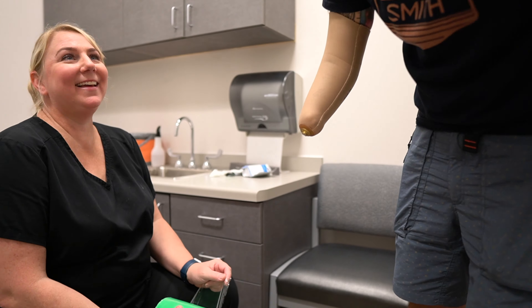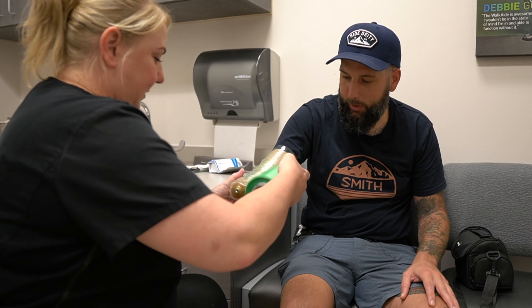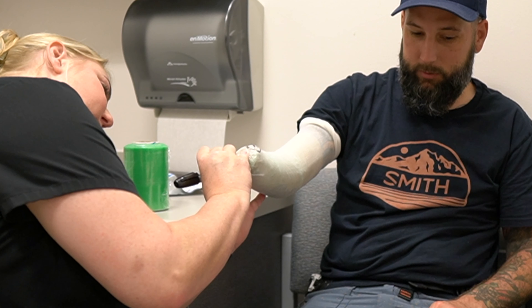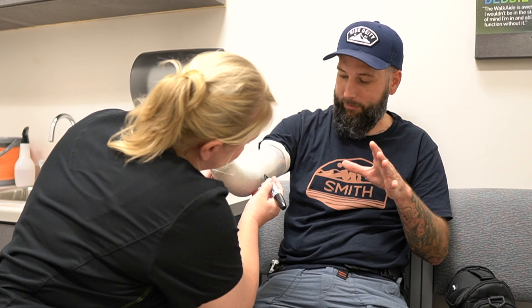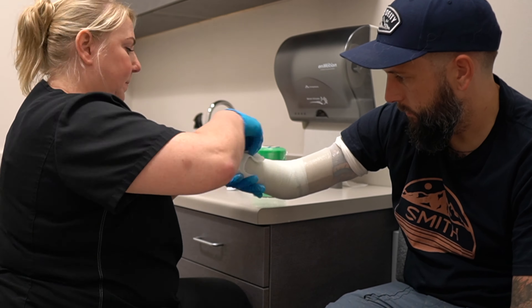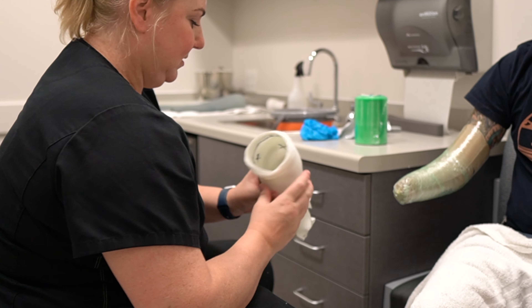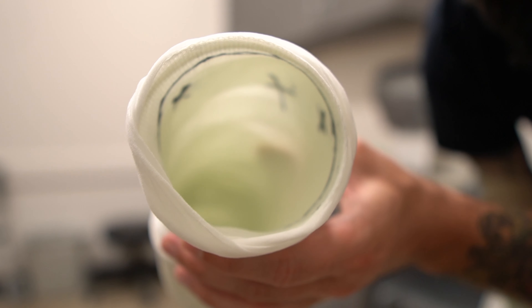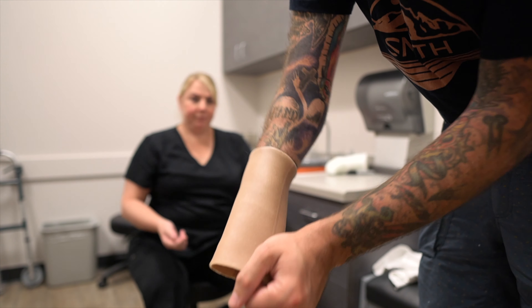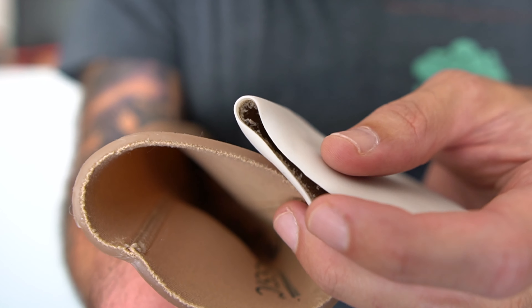I put on a liner and then the doctor wrapped it in cellophane to compress my skin and simulate the pressure of a prosthetic — it has to be snug. Next is a really thin sock and the doctor makes marks with a Sharpie to indicate where certain bones and muscles are in my arm. Next is wrapping a gauze that's basically like a cast so they can make a mold for the prosthetic. After a few minutes it hardens up. Here you can see the inside where they mark the sock at different points. And here's the liner — it's a buffer against my skin, basically something like a wetsuit. This one is way thicker and more spongy than my previous one.